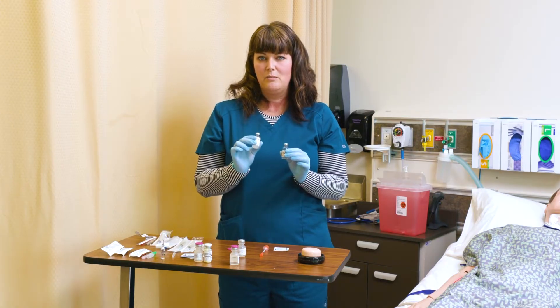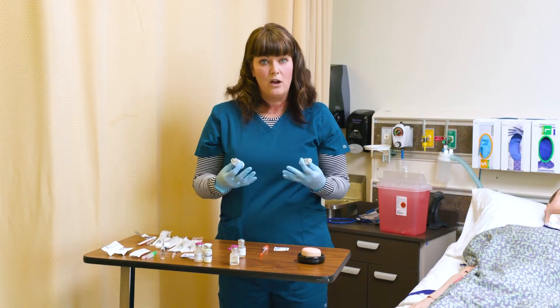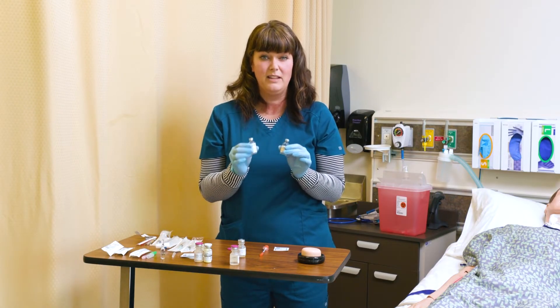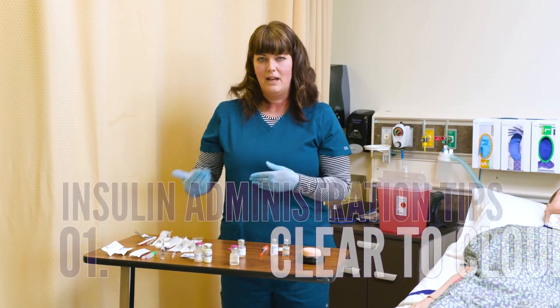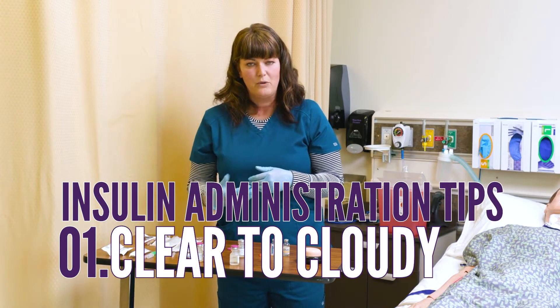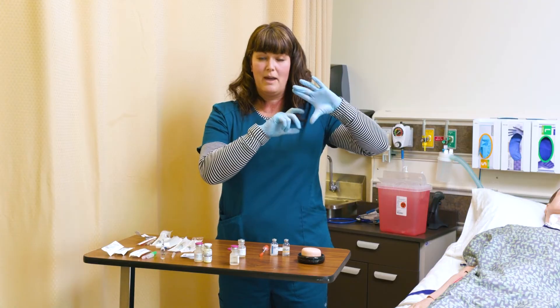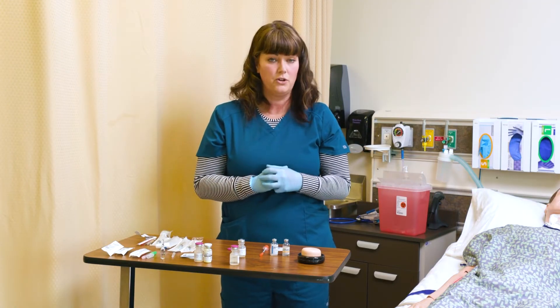If I were to get some of this NPH insulin into the regular insulin, it would start to break it down. So I need to be very careful not to contaminate these or mix them in an improper way. The rule here is clear to cloudy — I draw up clear first and then I draw up cloudy. I'm going to be very careful not to inject the other type of insulin into the wrong vial.